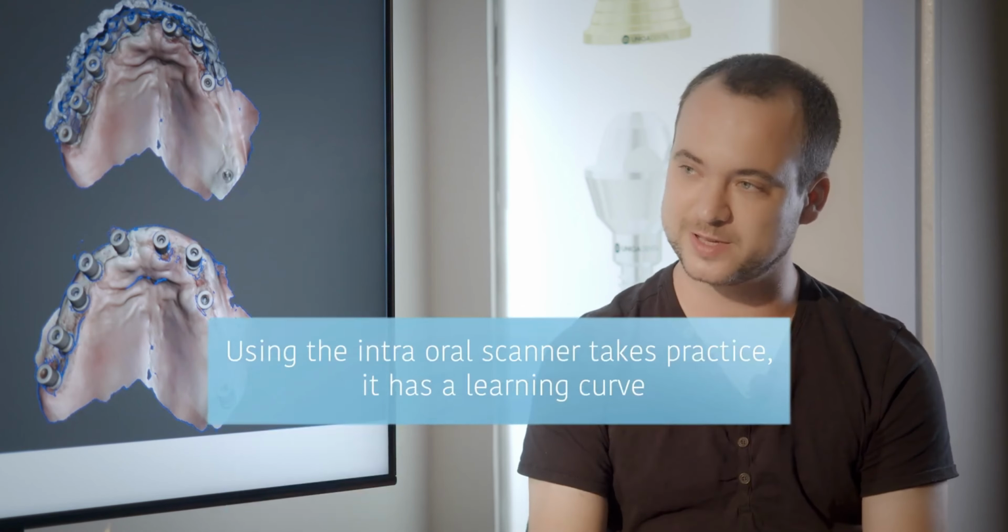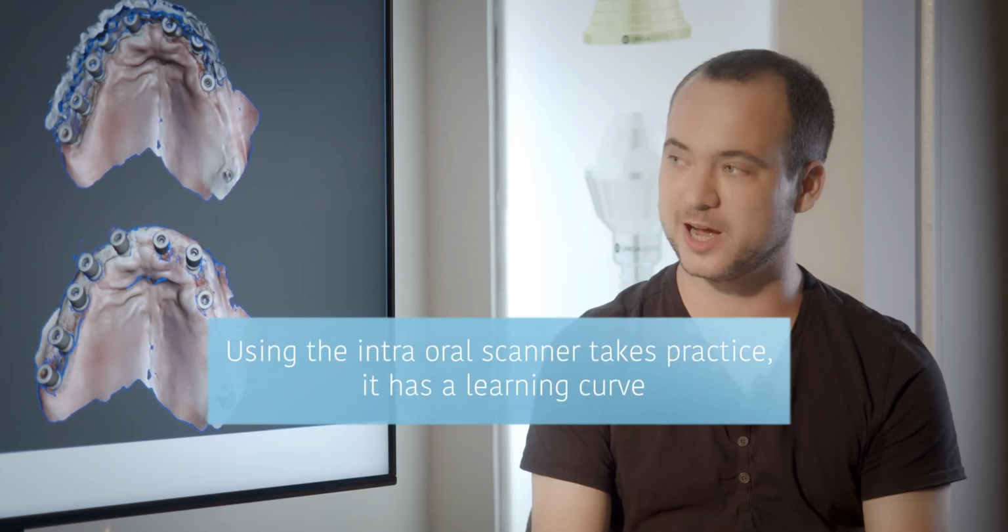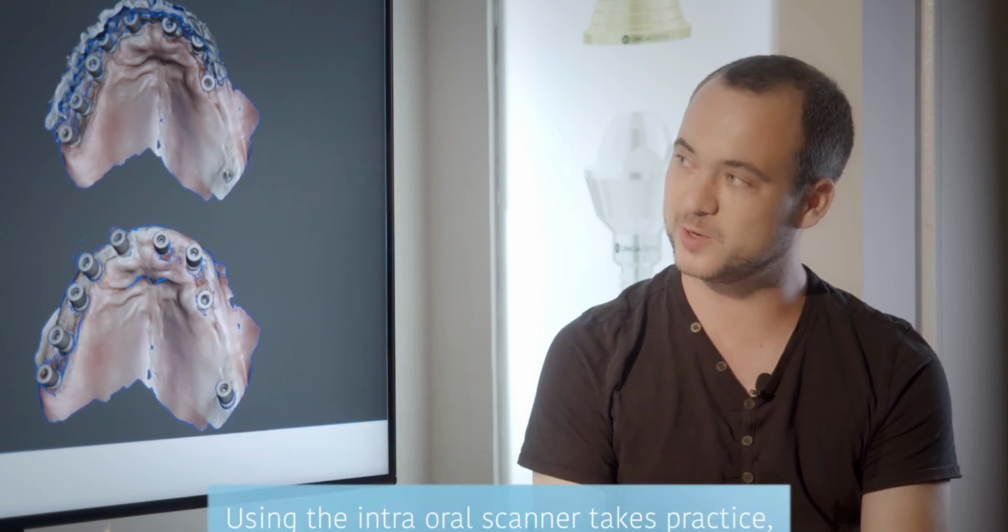You need to start with something small and learn how it works, because you have some things you can do to ease the work. With time, you understand that you need to have a dry gingiva for the gingiva to scan better. The upper jaw is much easier to scan because of the hard palate that you have.